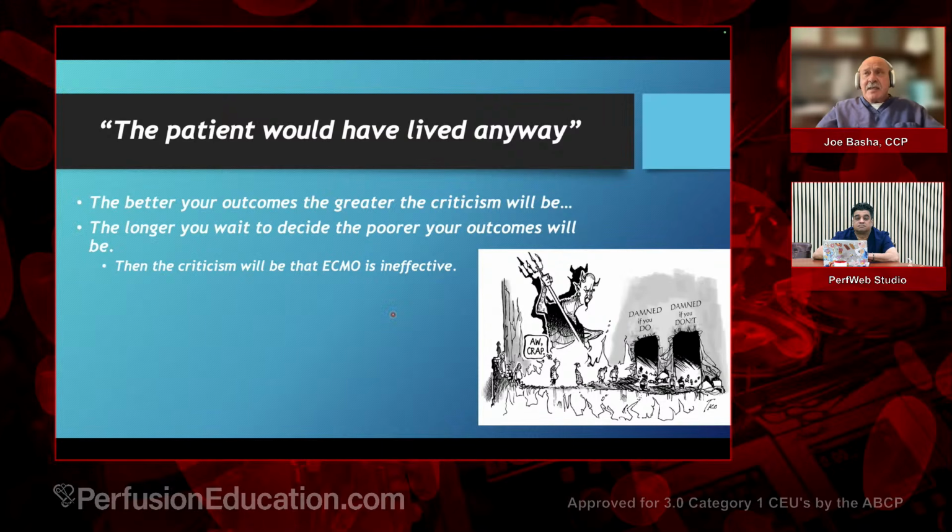It can be life-saving, it can be life-sustaining, it can give the patient an opportunity to heal through whatever therapeutic modalities we can go through to help them with their infection or whatever their issue may be that's causing this problem, another device, transplant, bridge, whatever it is. But the fact of the matter is that you can put somebody on too early and you can put somebody on so late that the outcome is predetermined. Too early, you can actually do harm. It is not a benign device. But where that cutoff is, is very subjective.